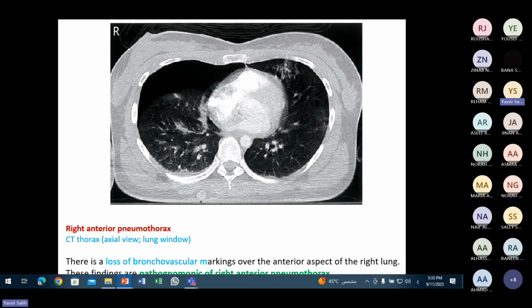As we said, pneumothorax can also be diagnosed by CT. Which side is normal, left or right? Left. So the abnormal is the right. Where is the abnormality? What abnormality do you see? Anteriorly on the right. Yes. There are no lung markings.